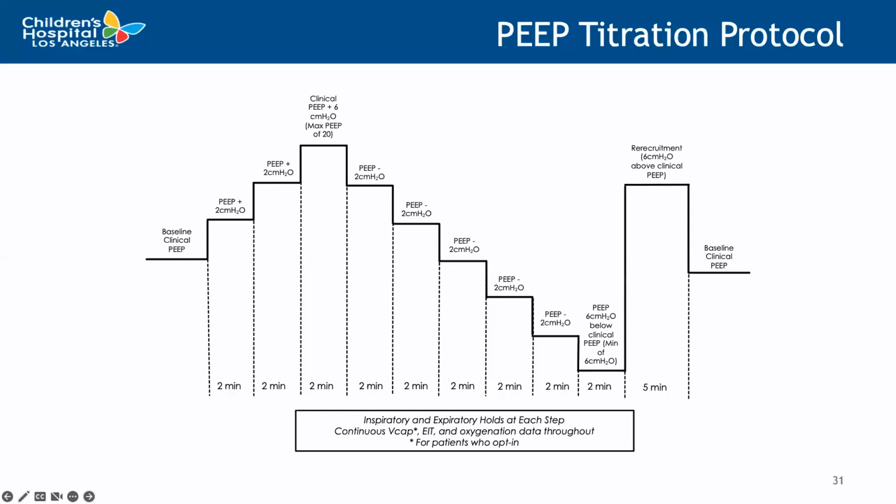Sometimes I think there's a thought that you go into the bedside and just start turning down the PEEP to see. But if you really want to get a sense of what is happening with the compliance of the patient, it's important to recruit them prior to doing the decremental PEEP trial.